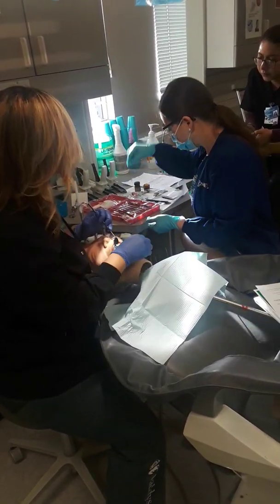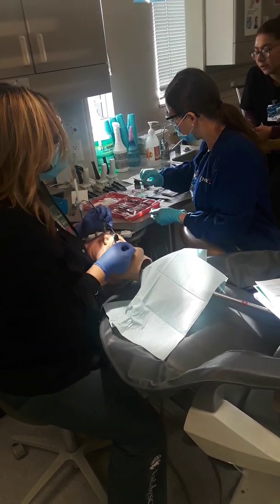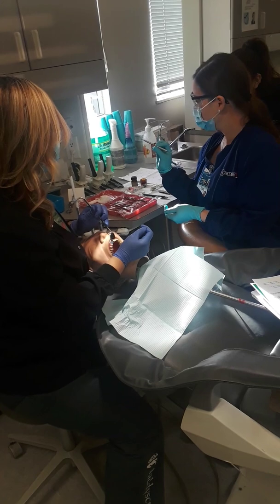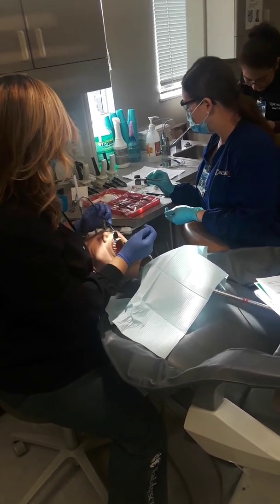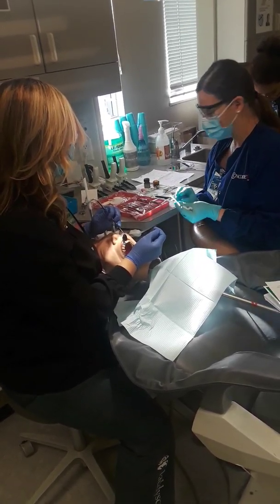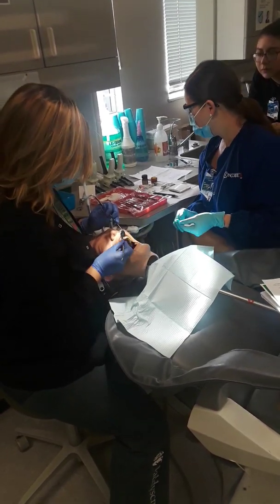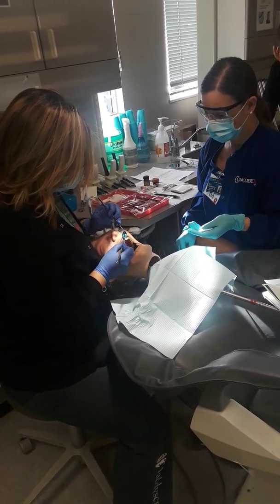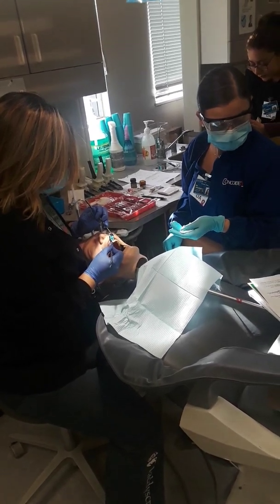She keeps the gauze in her hand because if I am spooning anything out, she's going to wipe my instrument. So the spoon, then go to the hatchet, right? The hatchet's the planing instrument to make everything smooth or level.